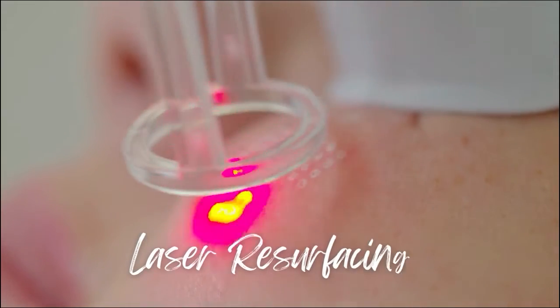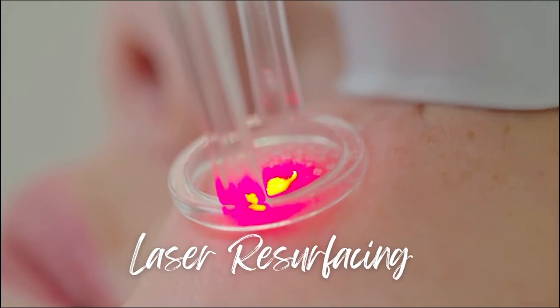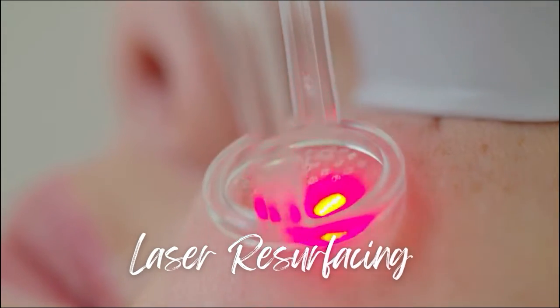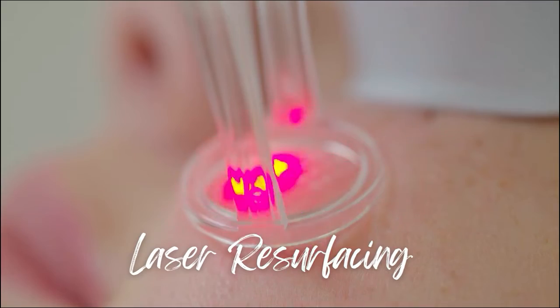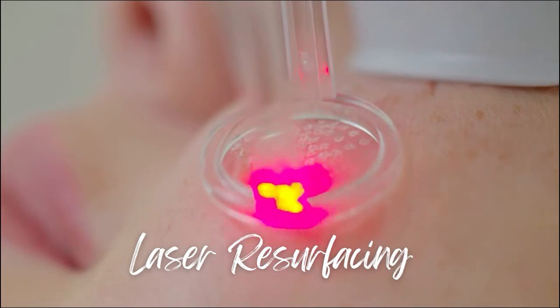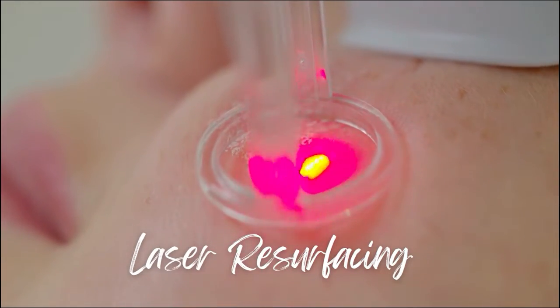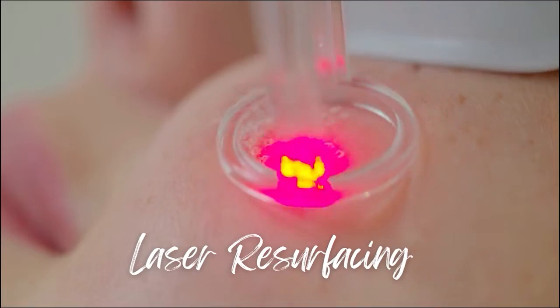Hi everybody! We're doing an exciting facial resurfacing today with a carbon dioxide laser. It's a very high-powered laser, so the carbon dioxide laser is great for laser resurfacing of skin, acne marks and pigmentation. So far, she's had a numbing cream on for the past 45 minutes. Then we're going to get started with the laser.